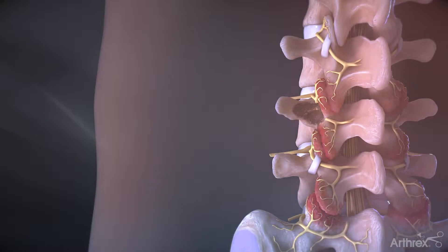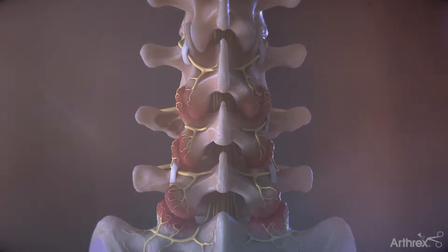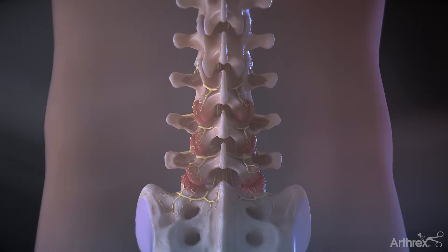Once complete, the scope and cannula are slowly removed. Repeat the process to treat any additional affected levels.